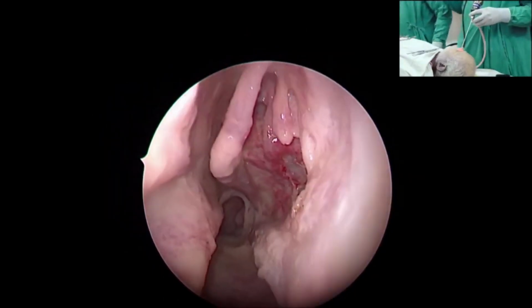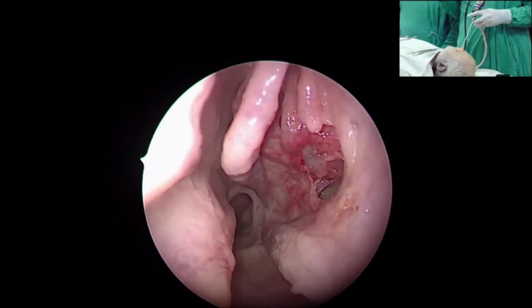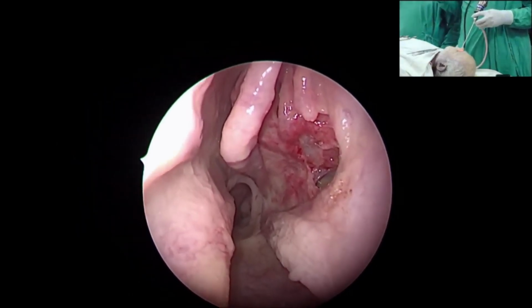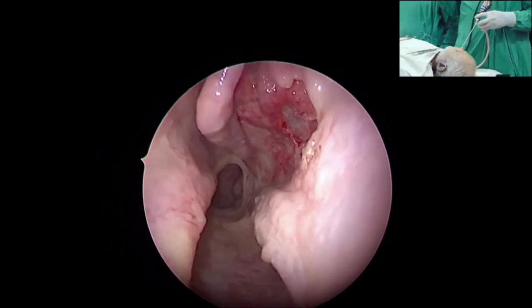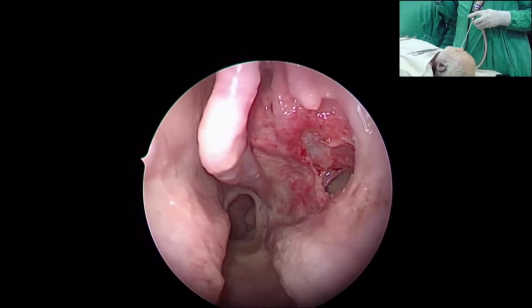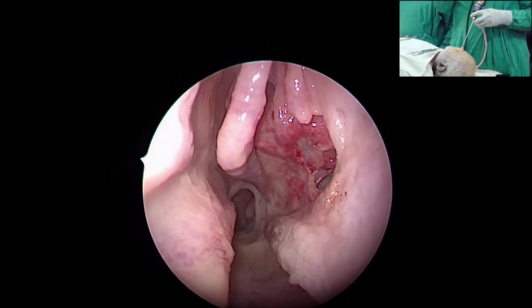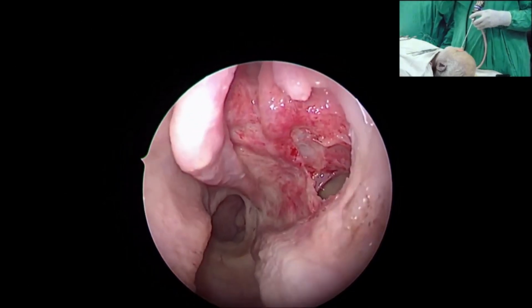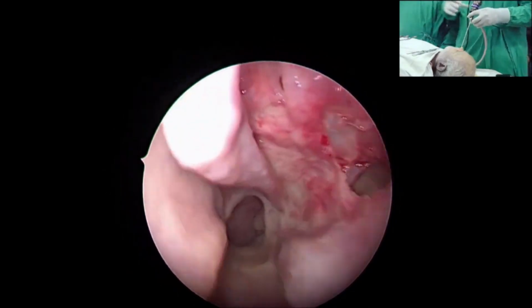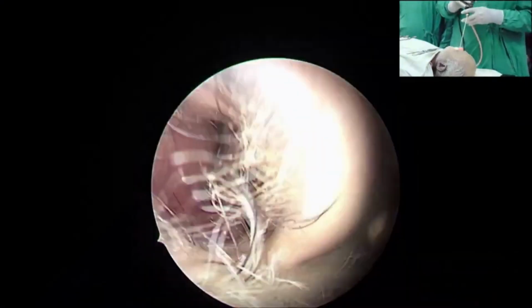And you know, in the sinus surgery we discussed in the first webinar, the goal of sinus surgery nowadays more and more is to introduce post-operatively steroid solution. And if you get a lot of synechia, that defeats the entire purpose. So, as a small step, what Samir has mentioned to prevent synechia formation is the introduction and bringing out the instrument, how you do it matters. And that is an important point in our practice.